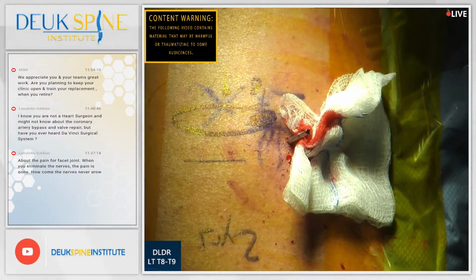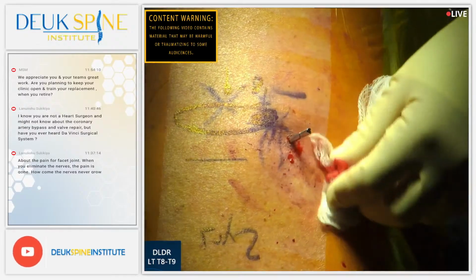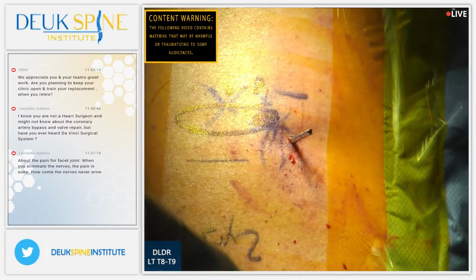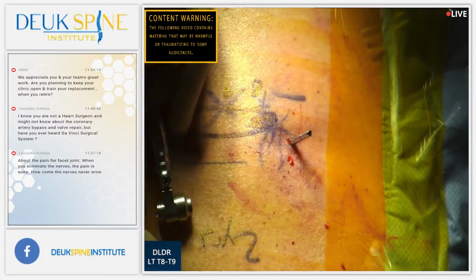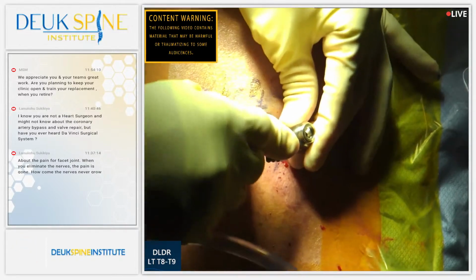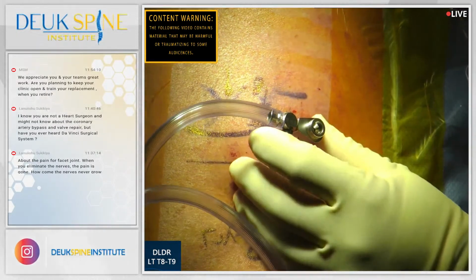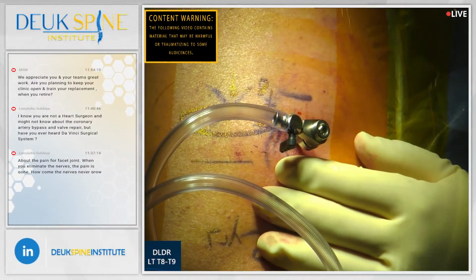All right, we're inside the tear and the herniation right now at T8-9. Once again, we did our discogram. We did not get a number from the patient, which we like to get, but we did get a response, and it was painful and concordant. Patient was a little bit too sleepy at the time to give us a number. Good news, he's stable, everything's going well. We're going to start the laser disc repair.